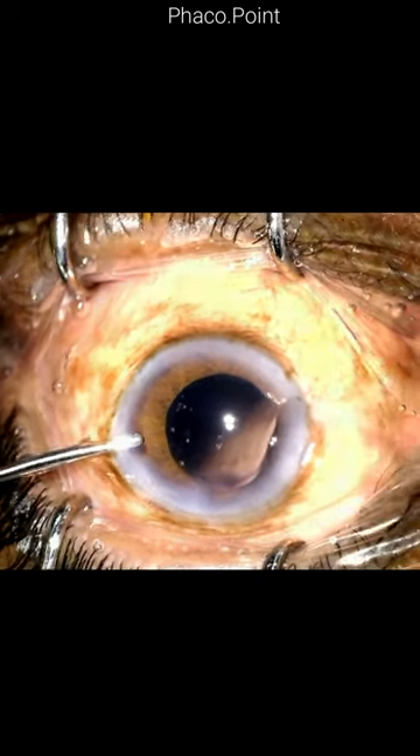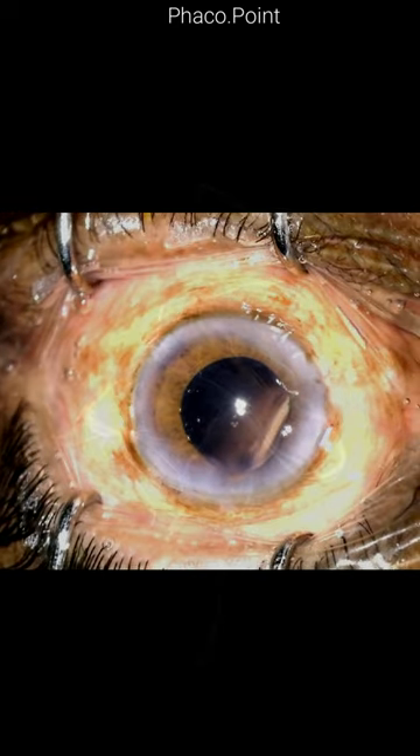The cannula is then removed, followed by the removal of the irrigation cannula itself.